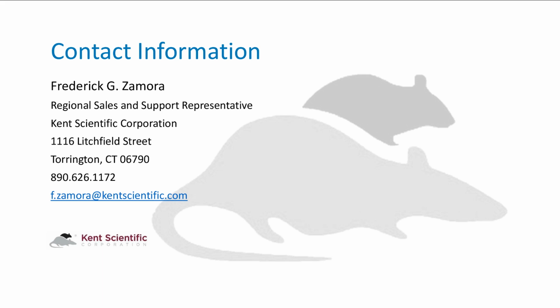In that last video you saw for the SomnoFlow, you have your preset buttons that you can use for your flow rate. That will have your preset flow rates for either the face mask or the induction chamber. But as we know, sometimes you get that rogue animal that just doesn't want to stay down. So while the procedure is running, you can actually use the dials on the SomnoFlow to adjust either the percent isoflurane or the flow rate as well.